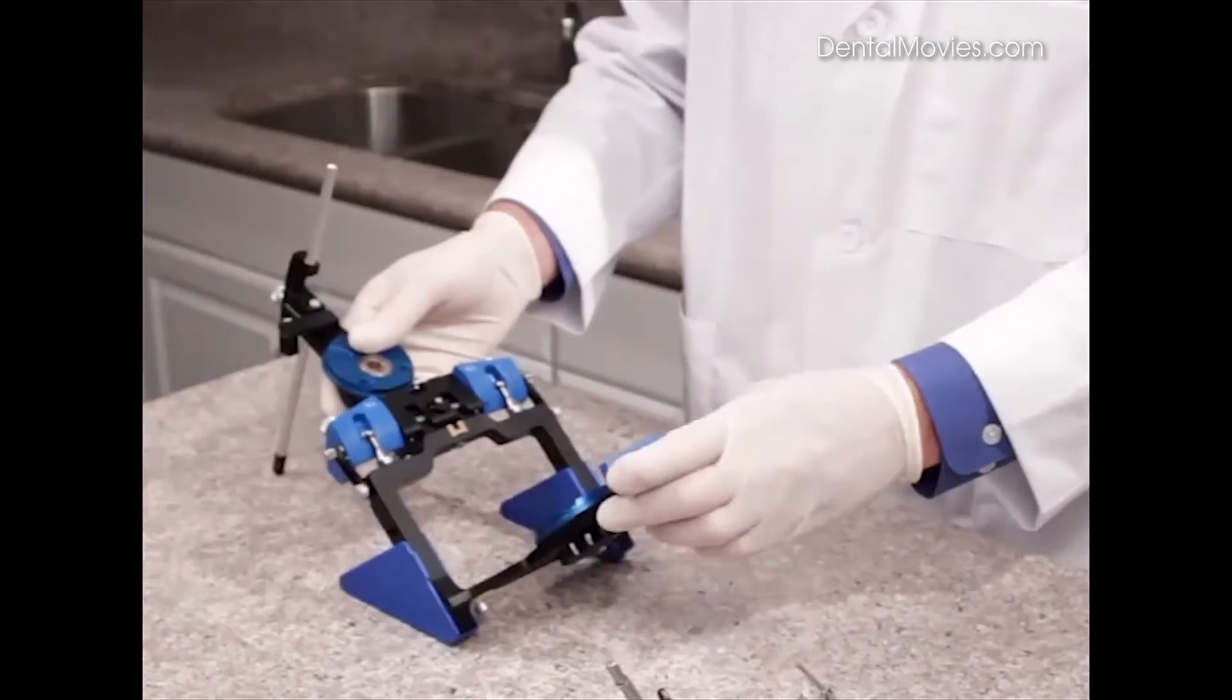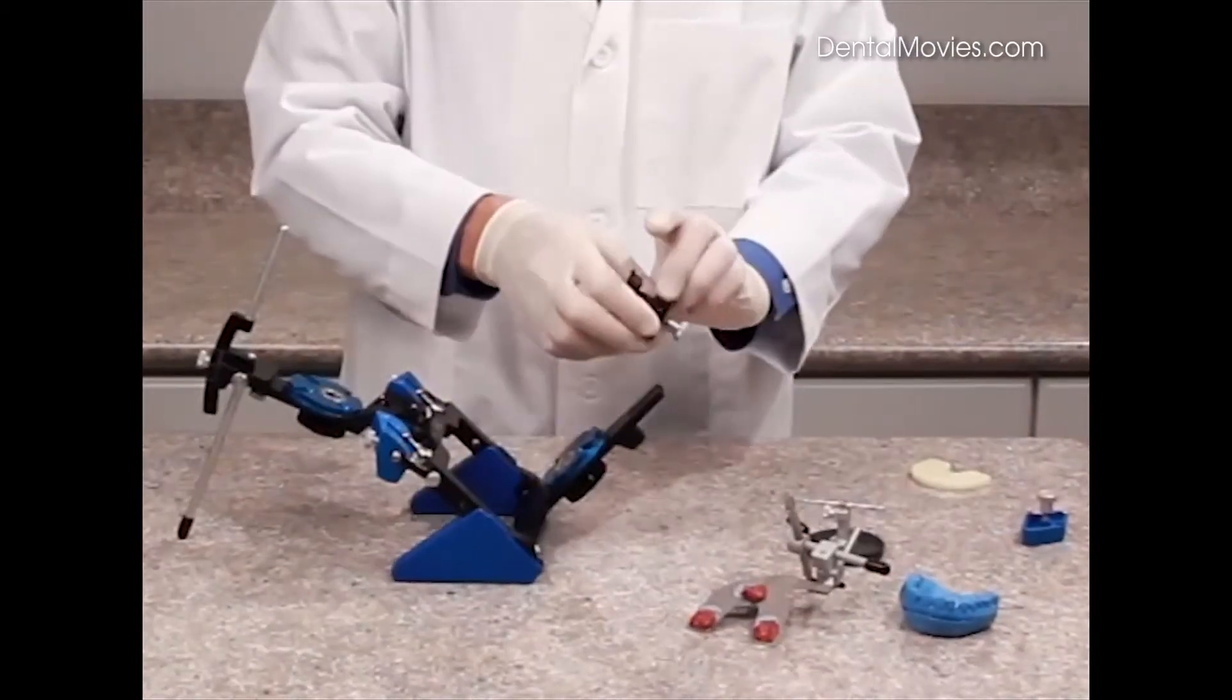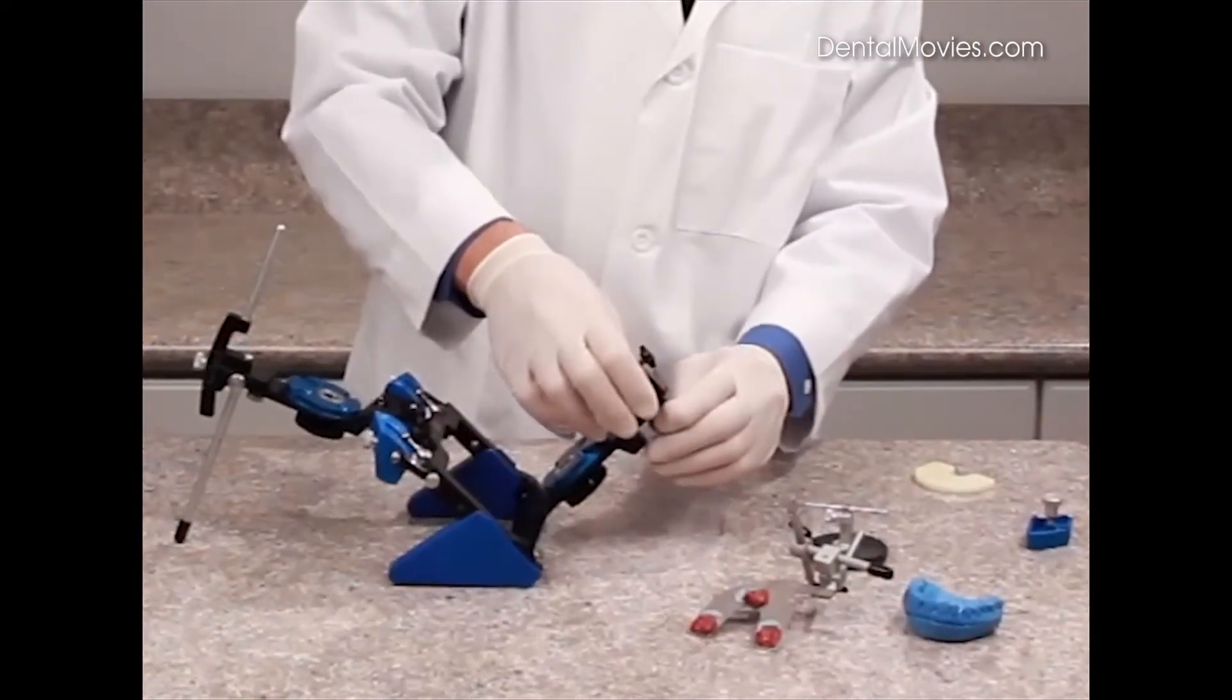Now swing this back, and we do want to remove the incisal table and replace it with the mounting fixture, which slides into place and tightens with the screw.